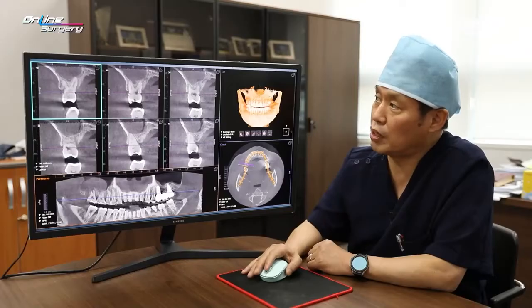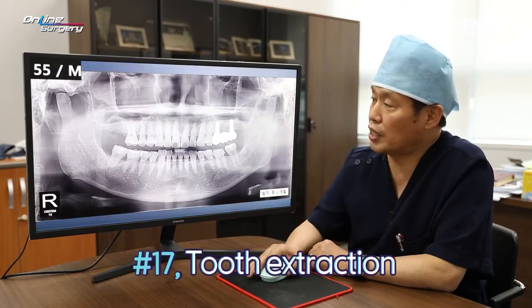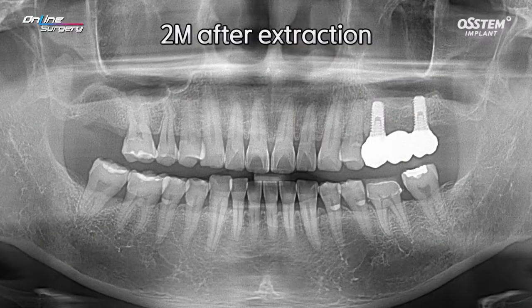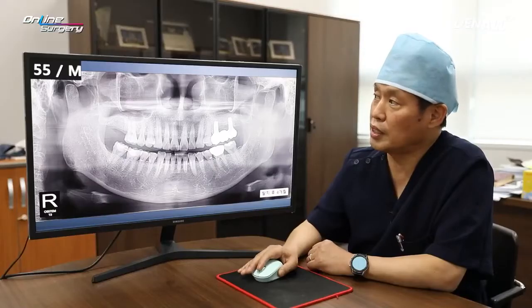The patient complained of severe pain along with mobility, and extraction was done. This is the panoramic X-ray two months after extraction. However, the alveolar bone is not fully healed, so I decided to wait a little bit longer. This is at four months — there is somewhat healing visible here.